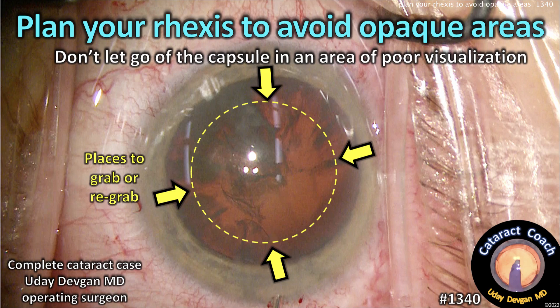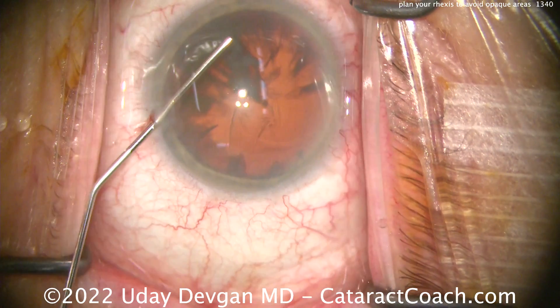CataractCoach.com. Plan your capsulorrhexis to avoid the opaque areas. Don't let go of the capsule in an area of poor visualization.